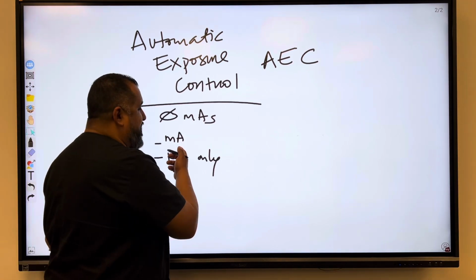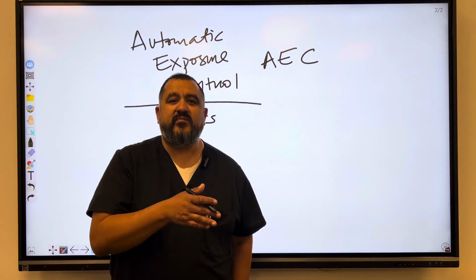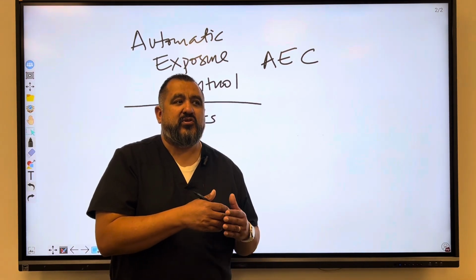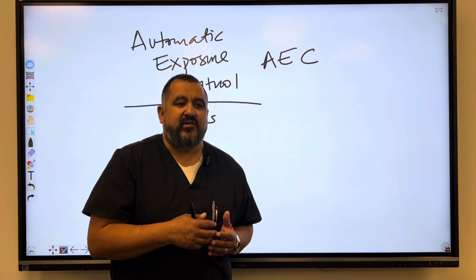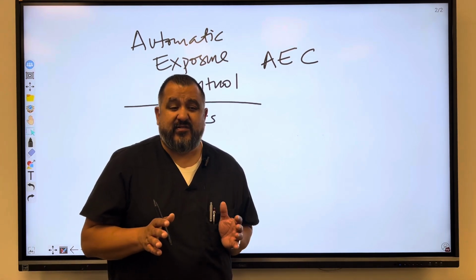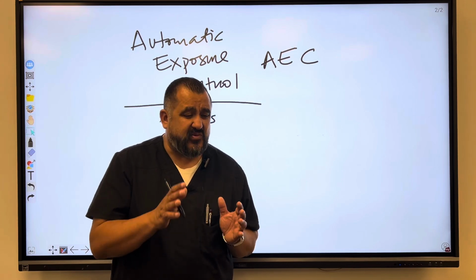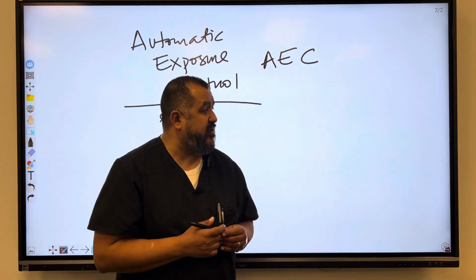So mAs is mA and time, correct? So that's exactly what you're losing the ability to do, select the time, but you're letting the automated system do that for you. And again, it's all based upon the part thickness, the size of the patient, and the patient's condition, like certain pathologies, we'll talk about that. That's going to impact AEC, automatic exposure control.